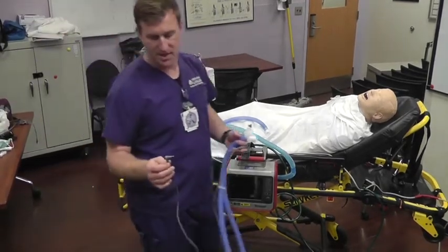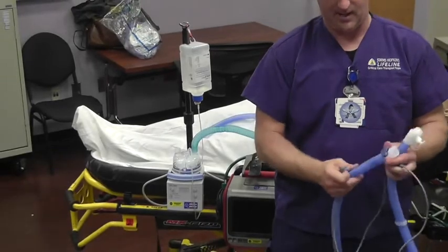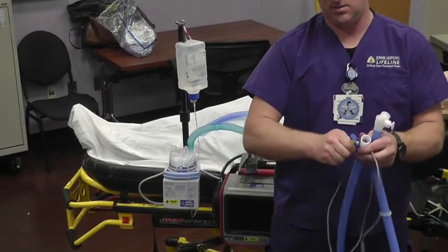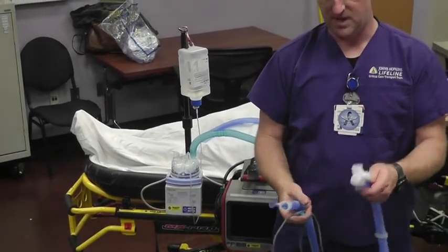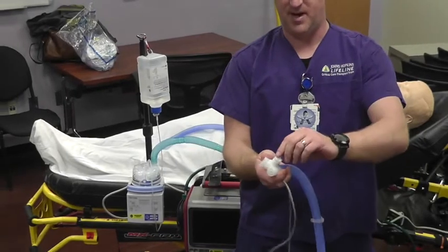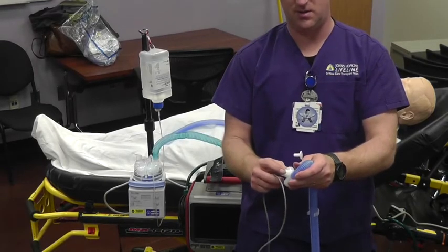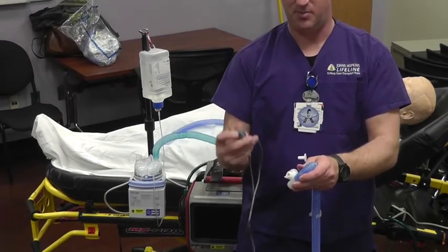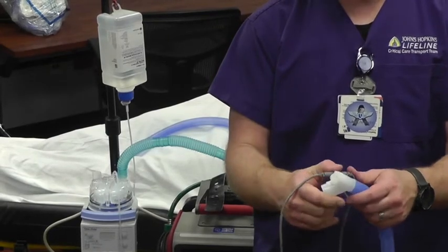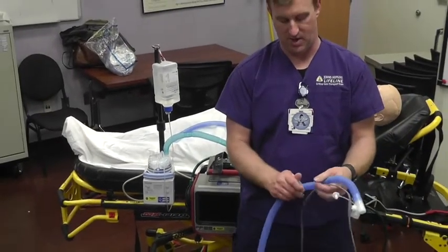The blue wire has a 90-degree angle on one side — take that 90-degree angle and put it at the patient end. Pull the little blue end out and push your 90-degree adapter in. Down at the other end, on the 45-degree angled end, pop the cover out. If you look closely, there's a little triangle on the blue wire — push those two triangles together. They're pressure-fitted. Along the length of the tubing there are some clips — go ahead and clip the wire underneath those.